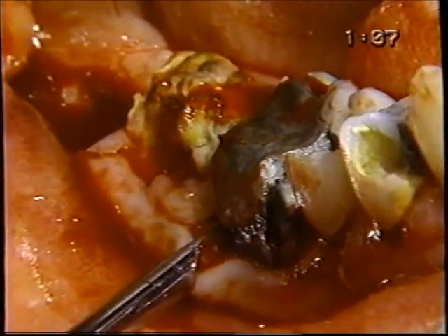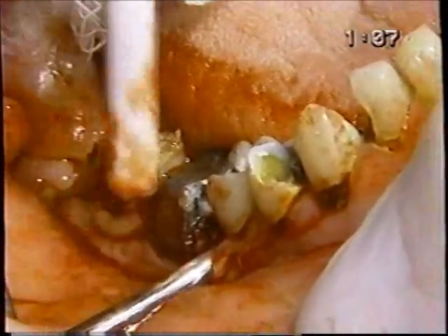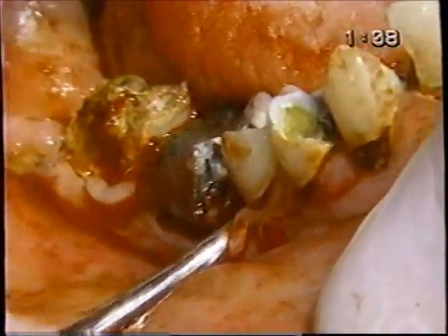Generally, second molar roots are fairly straight and conical. In fact, how's that? Let's just leave that one for a minute. What do you want to bet? This huge amalgam is going to come out. Okay, the 301 is certainly the workhorse of oral surgery. That and the universal forceps.